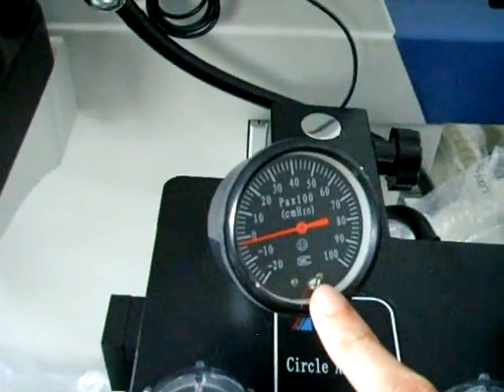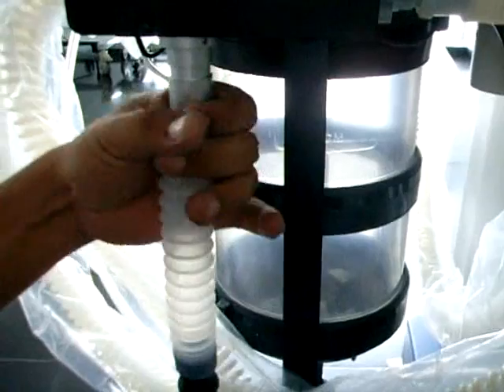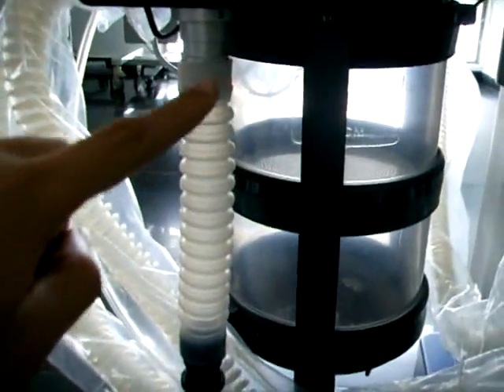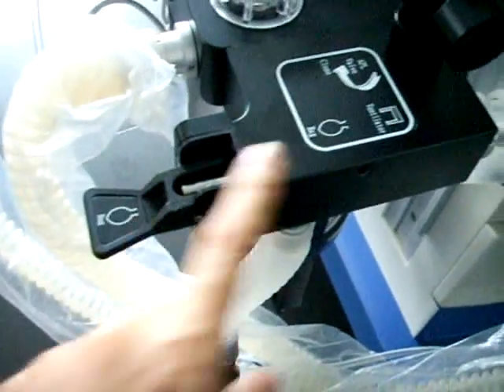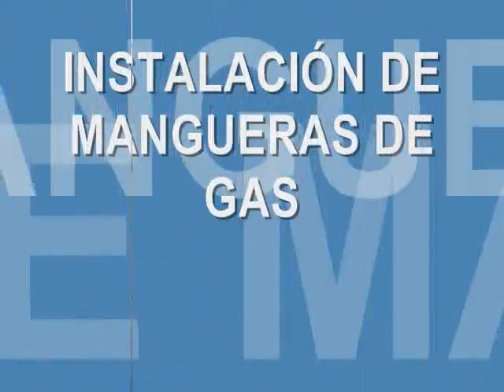Ajustamos la perilla del manómetro por medio de un destornillador con el tornillo inferior y garantizamos que este se encuentre en cero. Para la instalación de ventilación mecánica podemos hacer uso del extensor, como se observa en el video. Garantizamos que este quede completamente conectado a la parte inferior del canister, y el otro extremo pueda ser usado por medio de un pulmón de prueba, el cual será el camino por el cual el profesional pueda hacer ventilación mecánica. Recordemos hacer el cambio para que la máquina quede trabajando en ventilación mecánica.